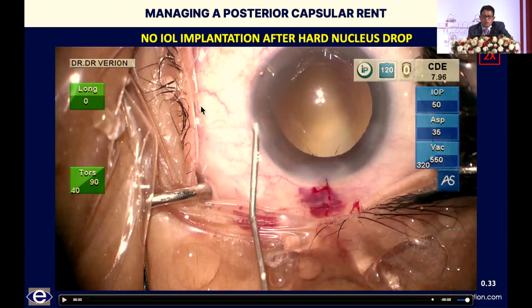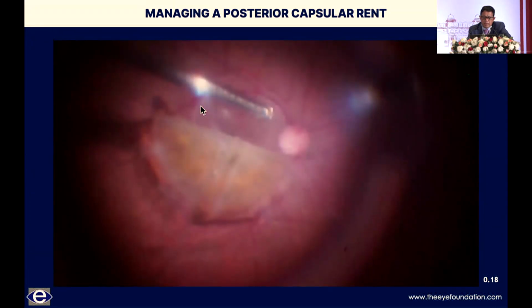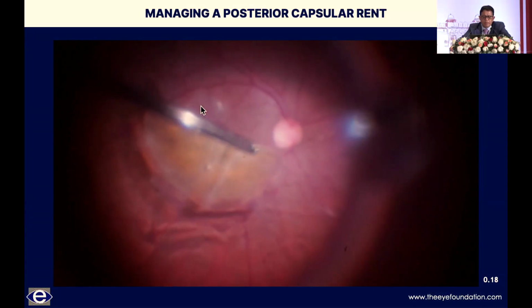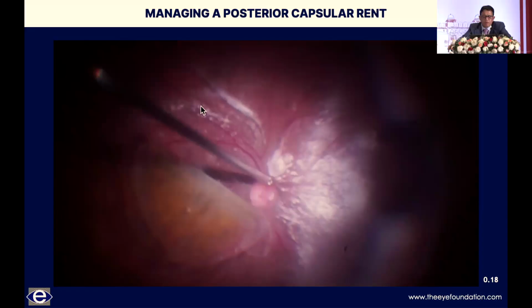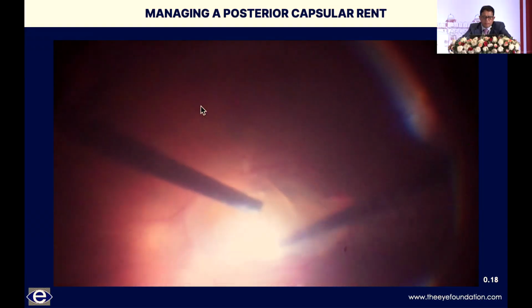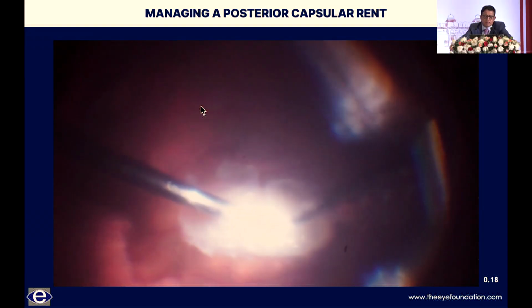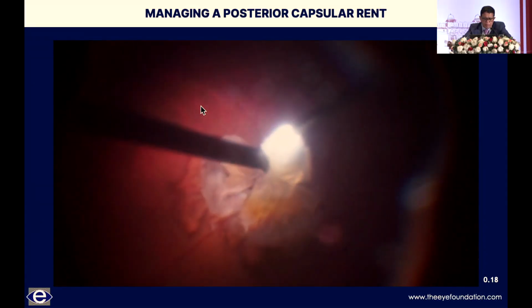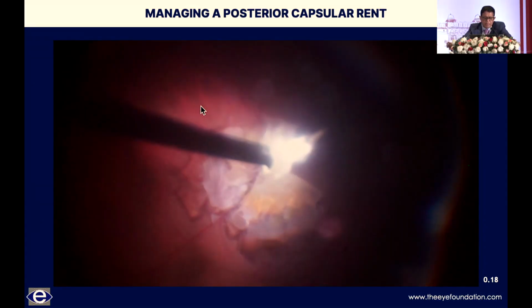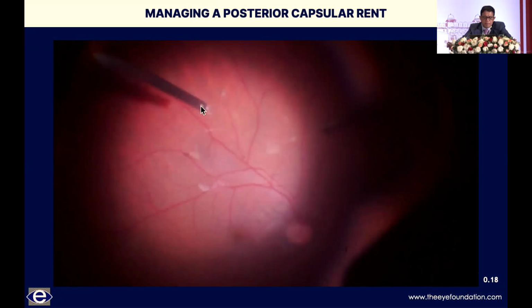I think the most important message is not to chase this. As you can see, this is the final video of mine. This is the kind of treatment that a dropped nucleus requires. When you chase it with your Vectis or something, you create considerable traction on the vitreous base, on the pars plana, creating dialysis, etc. And CME is a difficult problem to deal with. So when it has gone beyond your limits, better refer it to a VR colleague.